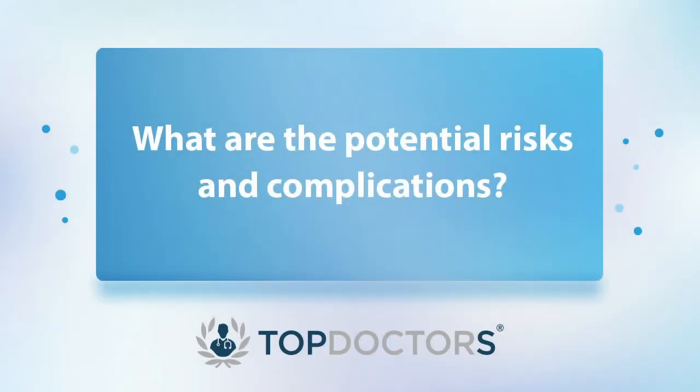Majority will be able to stop their medications, such as tamsulosin and finasteride, to relax the bladder neck or to shrink the prostate with all the side effects involved. So that's another positive that allows men to consider Rezum or steam ablation of prostate. Thankfully, there aren't any major risks.